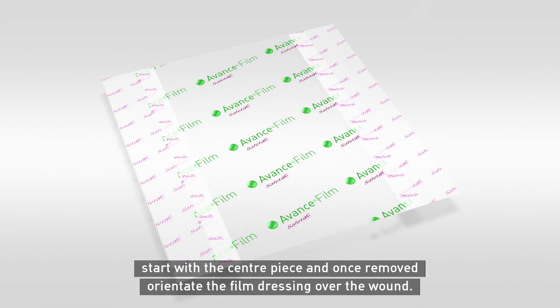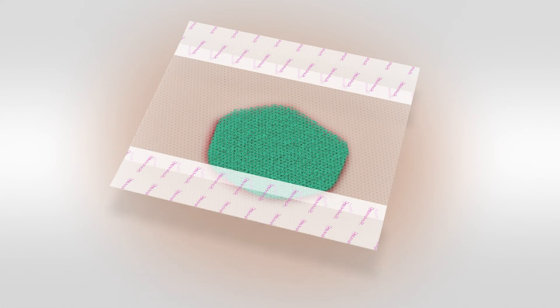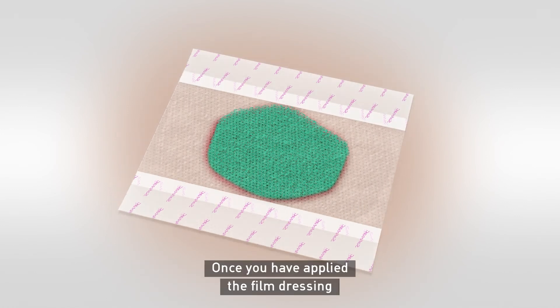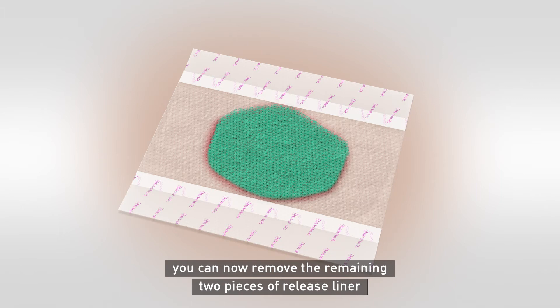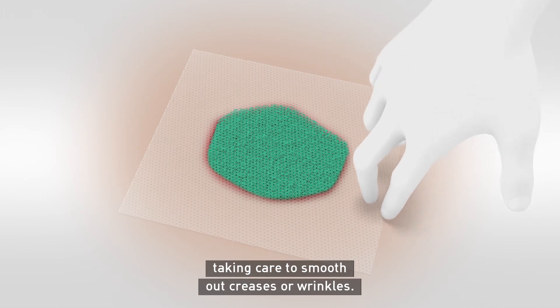Remove the release liner from the film dressing. Start with the centre piece, and once removed, orientate the film dressing over the wound. Once you've applied the film dressing, you can now remove the remaining two pieces of release liner, taking care to smooth out creases or wrinkles.